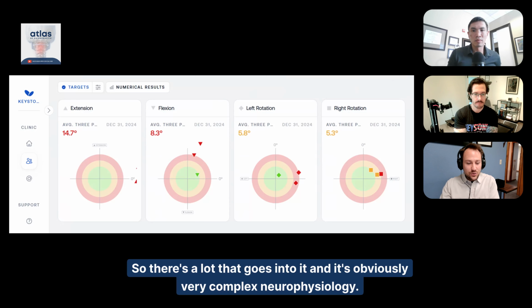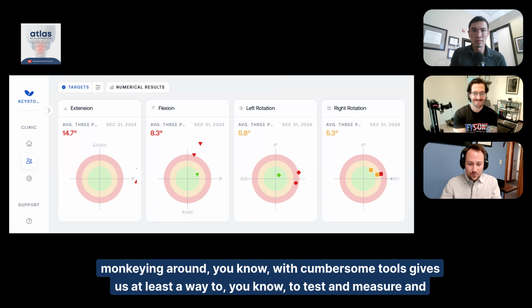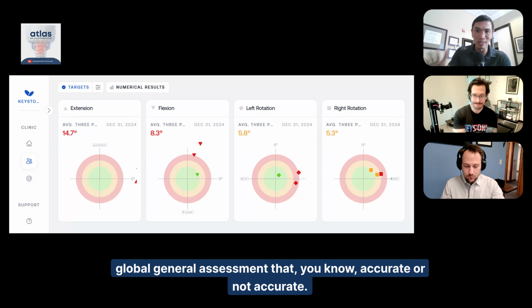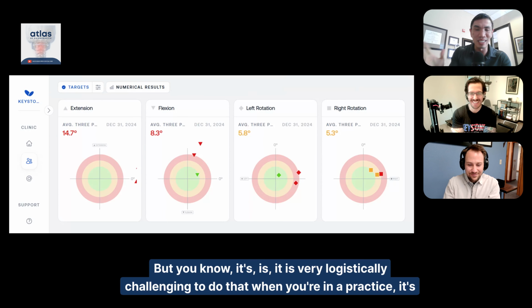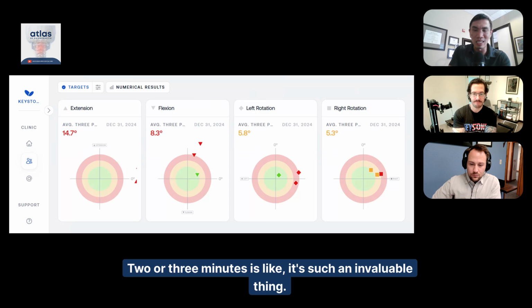So there's a lot that goes into it, and it's obviously very complex neurophysiology. But again, the fact that we can measure it very accurately, very efficiently, without a lot of monkeying around with cumbersome tools, gives us at least a way to test and measure and to track over time. Previously, when I didn't have NeckCare and I just did this all analog, I would just take a global general assessment. I could have a staff member take a ruler to it, but it is very logistically challenging when you're in a busy practice. So the ability to just turn the head, bring it back, and do it within 2 or 3 minutes is such an invaluable thing.